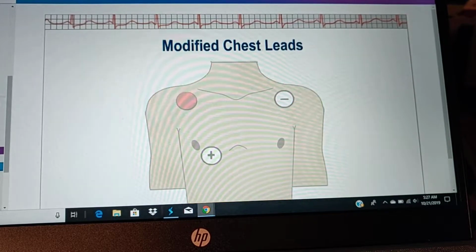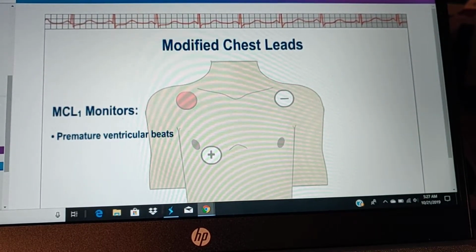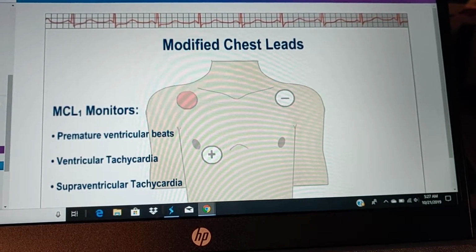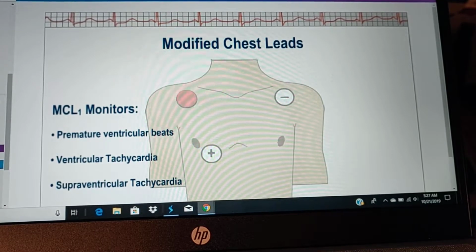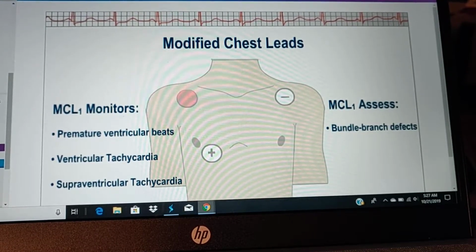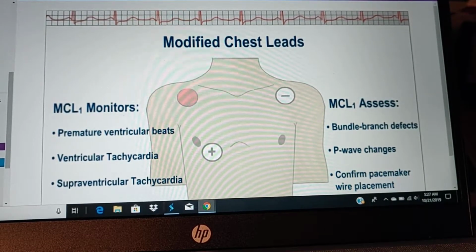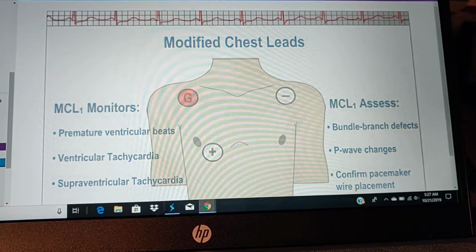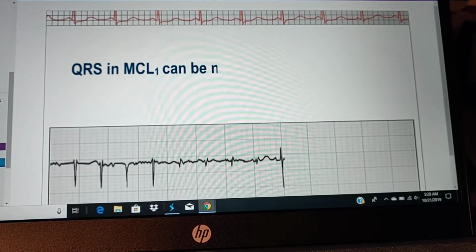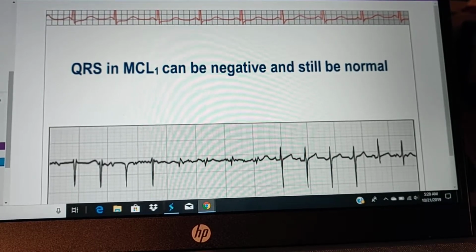Use the MCL1 to monitor premature ventricular beats and to distinguish types of tachycardia, ventricular and supraventricular. It can also be used to assess bundle branch defects and P wave changes and to confirm pacemaker wire placement. It is important to note that the QRS in MCL1 can be negative and still be normal.